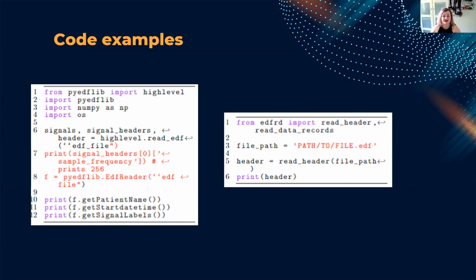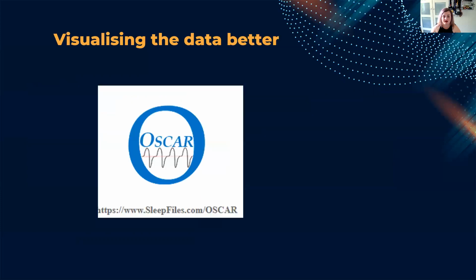But I wanted to find out, how do I visualize the clinical aspect? I've now looked at the engineering side of things, how the device functions. I have looked at what's contained in the EDF files. I've looked at the file system, but I wanted to visualize the sleep data. Now, in comes OSCAR, which is an open source CPAP program that is used by the community that does have CPAP. And it's quite amazing what you find in the information that they're willing to share.